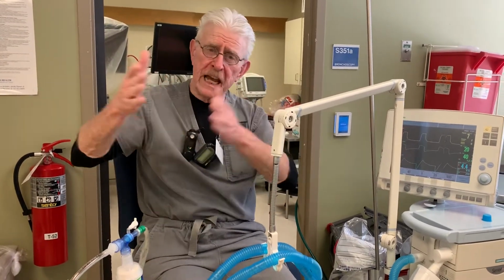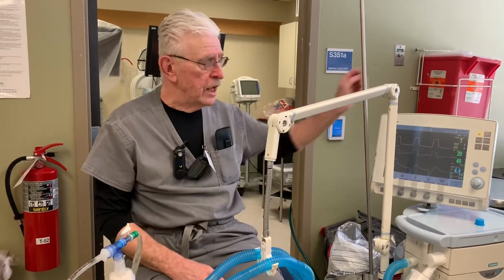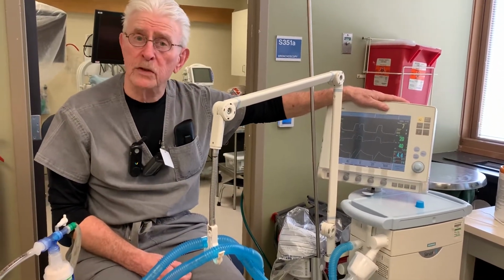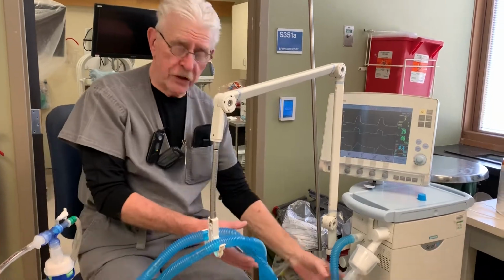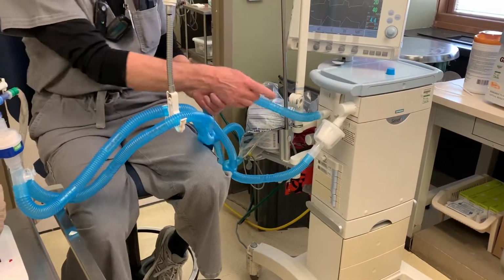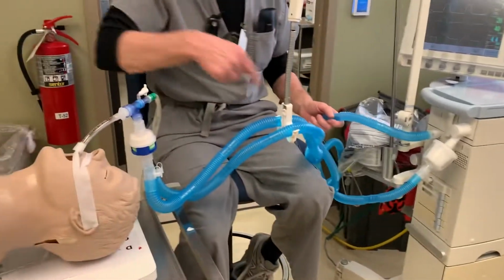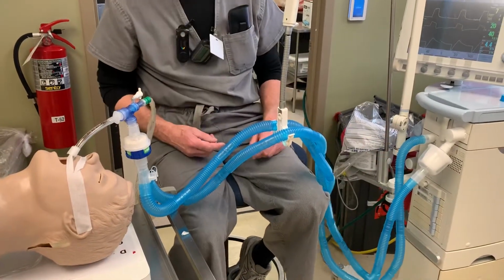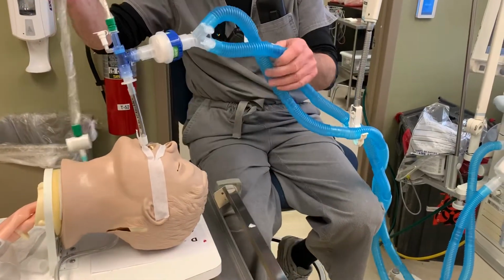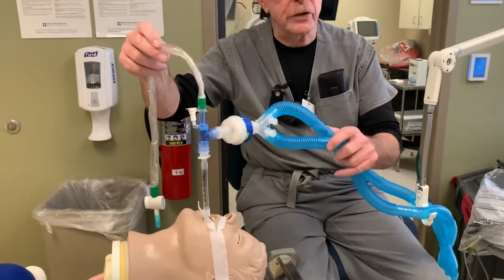Mechanical ventilation is generally seen in three separate but conjunctive parts. One, the ventilator itself, this is a Servo-i, what's commonly used here throughout the hospital. Two, the circuit, which is usually two distinct tubings, one going to the patient and one returning to the ventilator. And three, the patient themselves, which is the discussion that takes into consideration the airway that you see that's in place here.